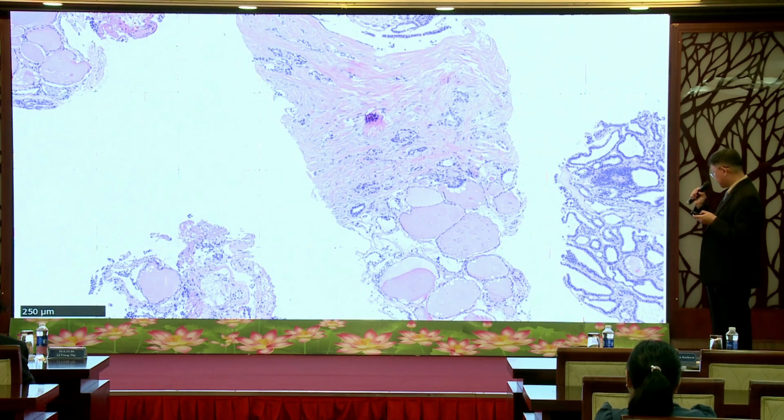However, when you look at the morphology, especially the nuclei of the cells in the atypical area, the nuclei look quite uniform and round in shape, and they are dark staining. When you see it in low magnification, the arrangement resembles papillary thyroid carcinoma in this case.